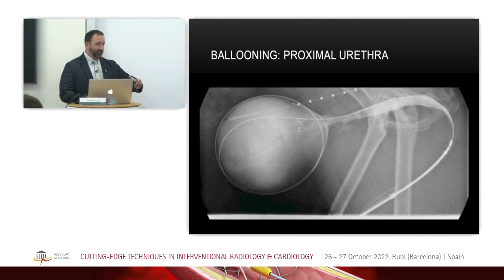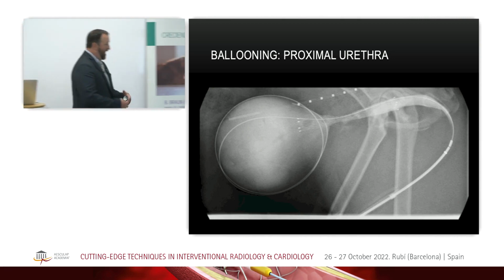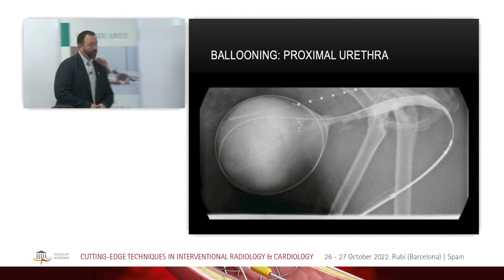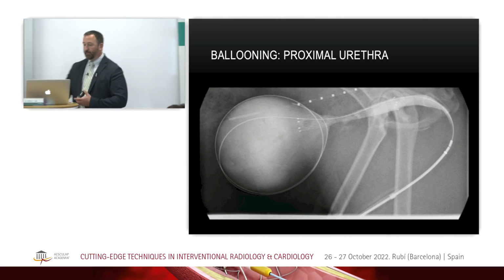And so this is kind of an example of going through the steps. And so not all of your balloonings end up in stent placement, but you kind of have to think ahead that that's potentially something you might run into down the road when you're doing these.